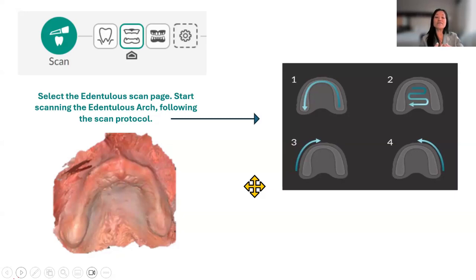And you can retract in different ways, but you don't want to pull the tissue back too hard. You just want to hold it in place as you collect your data. And Kelly, when we get further into it, she'll go over some tools and stuff that we can use when we're in that arena. Yes. And the next one.